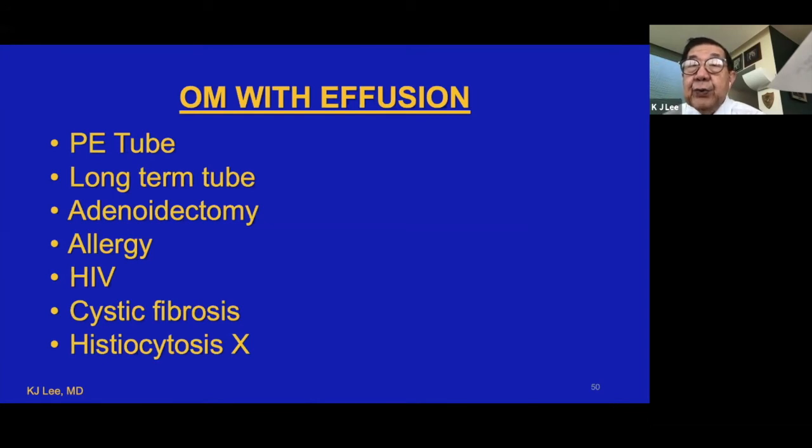A patient who comes in with recurrent otitis media with effusion. They don't have cholesteatoma, but they've got this problem. What do we do? We can put a PE tube there, and there is a good long-term tube by the past chairman at Stanford, a famous university in America. We have found it does very well, but it also creates granulation tissue. So sometimes it's easier to customize with a regular polyethylene tube and create your own PE tube for this patient. And there's another short lecture I give about how to make a PE tube very easily. Well, we don't have time for that today.